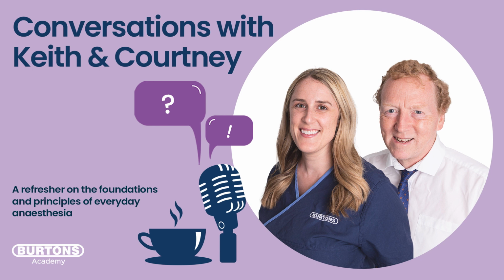So I wouldn't get too hung up about respiratory rates. I would go for a broad respiratory rate and then err on the side of overdoing it rather than underdoing it to start with. And then, as I said, without a capnograph, we're lost. But with a capnograph, we're going to look at our end-tidal CO2 once we're happily ventilating, and we're going to adjust that respiratory rate because that will affect our minute volume ventilation, and we'll adjust it accordingly to get the CO2 in roughly the right position. So again, not to worry too much about it.